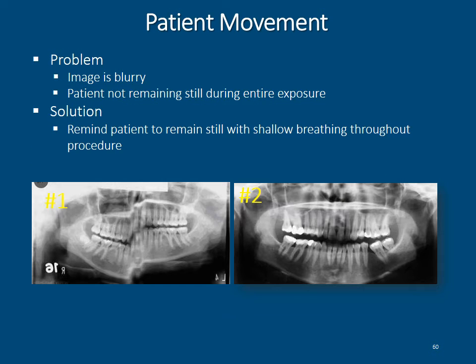I'd like to again repeat the problem with patient movement and the blurriness that does occur. Compare image 1 and image 2. In image 1, there has been movement, and you can see the whole quality of the radiograph is undiagnostic as compared to image 2.